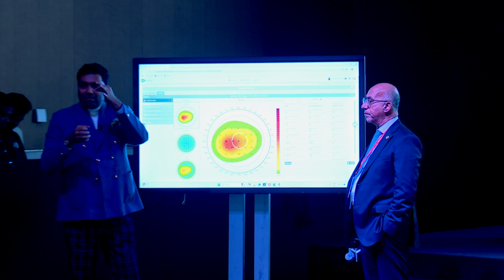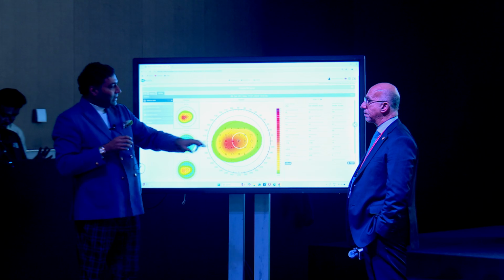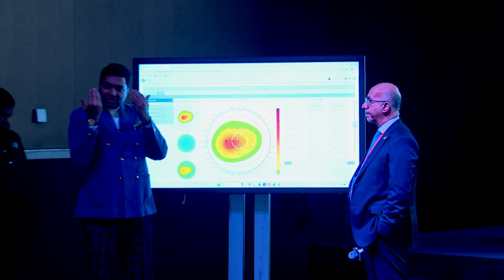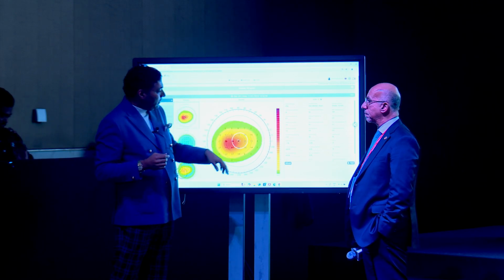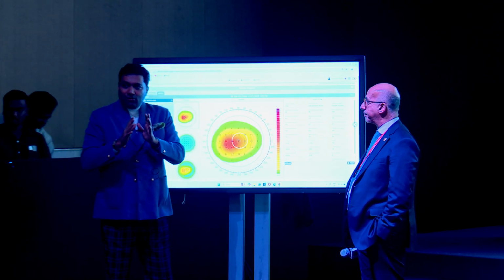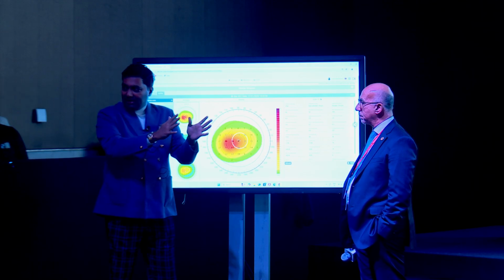You will ablate exactly on the zone which is going to the macula, and that zone is where it is trying to correct. By doing it, your ablation is lesser, and you are trying to create a much more organized way, and I'll show some results tomorrow. And this is a refraction, it is not the refraction you use on the patient, this is based on the ray tracing, what is necessary to make your cornea more regular.